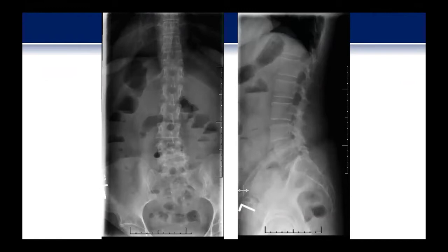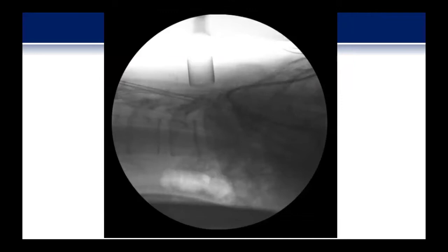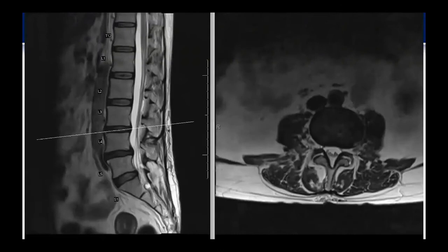These are her plain films. As you can see, she has a significant collapse on her standing films at her L4-5 disc space. It's asymmetric with more collapse on the right side than the left. This is her intraoperative film during her last minimally invasive discectomy — the localization film. While she's on the table in the prone position, she has a little bit of a spondylolytic anterolisthesis of L4 on L5, which is actually better appreciated on this image than on her previous flexion-extension films.